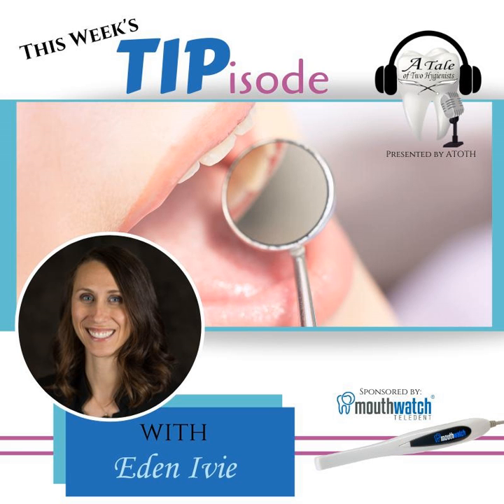Another way that you can use intraoral cameras in your everyday practice is for case presentation or treatment presentation to your patient. Without using an intraoral camera, our patients just have to take everything we say or the doctor says at face value. And often we're speaking to them in a language they don't understand. If we say you have an old amalgam that has ditched out margins with some crazed lines and maybe some fractures around it, they might understand one or two words out of that sentence, but they're not really going to understand why they need treatment.